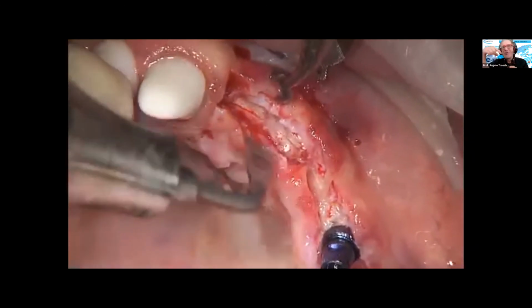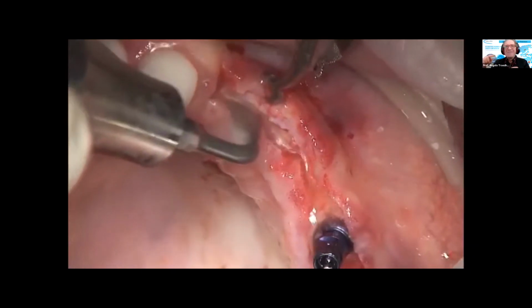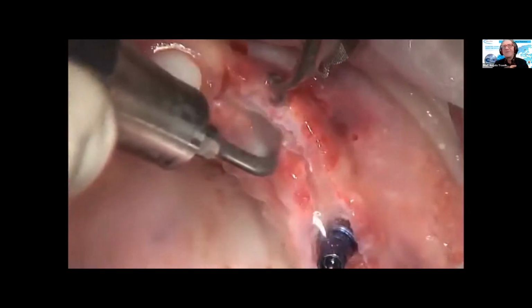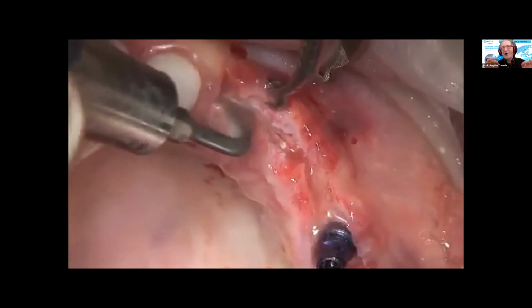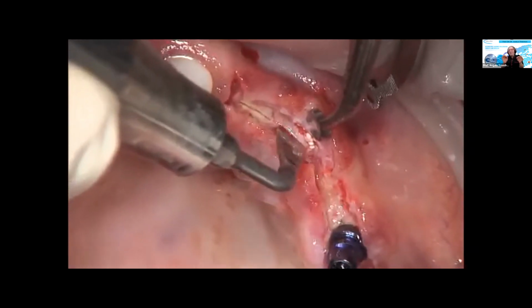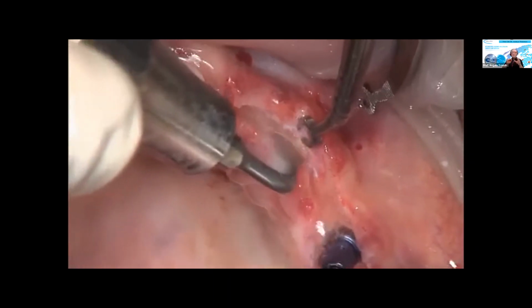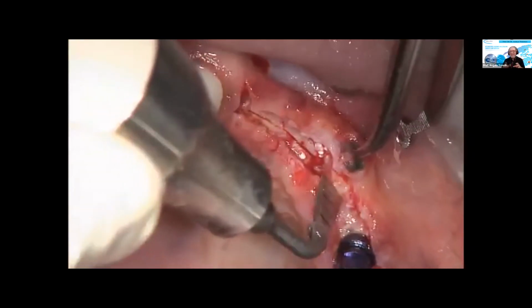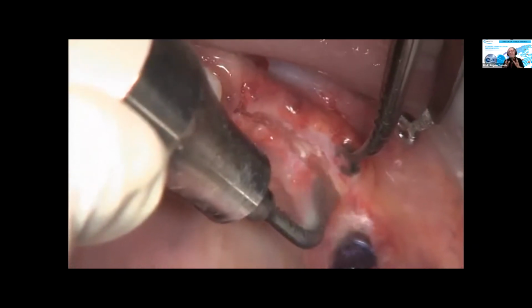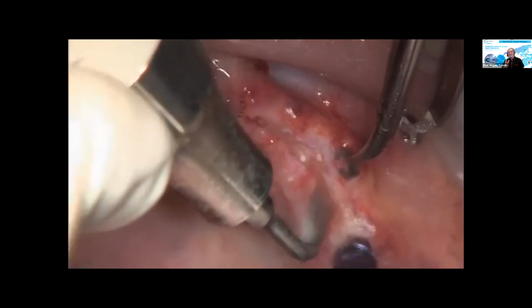Just imagine a rotary diamond coated wheel. How do you want to go around? How do you want to have a precise rectangular osteotomy? And of course, the diamond coated wheel, the rotary instrument, has to have a certain width, approximately 0.5 to 1 millimeter, to be sufficient in doing the osteotomy. In this case, you cut the bone lossless. You just open the gap, but there is no bone wasted by the preparation.